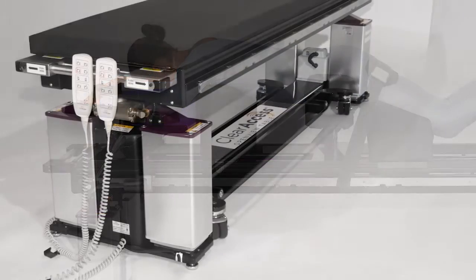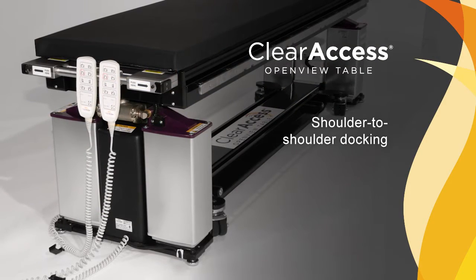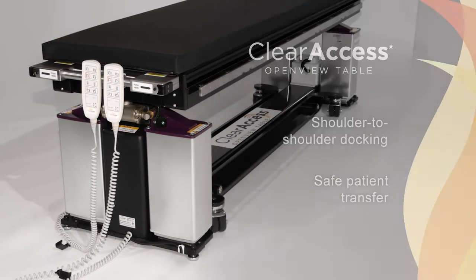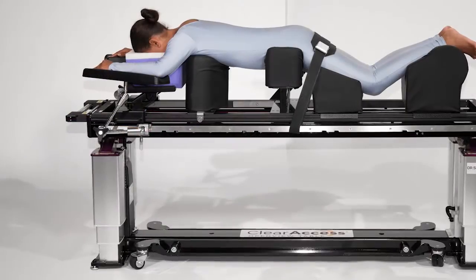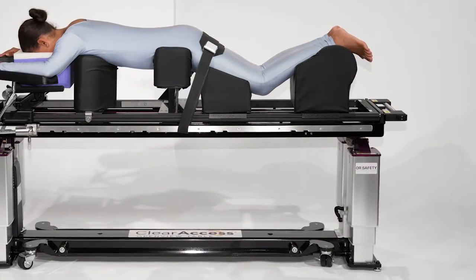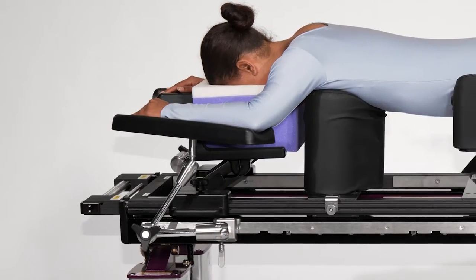Without outboard wheels, the table allows shoulder-to-shoulder docking with the gurney, which facilitates safe patient transfer onto and off of the operating platform. Finally, and perhaps most notably, there are no towers at the head or foot end, completely removing the need for T-pins and allowing anesthesia direct access to the patient's head and airway.